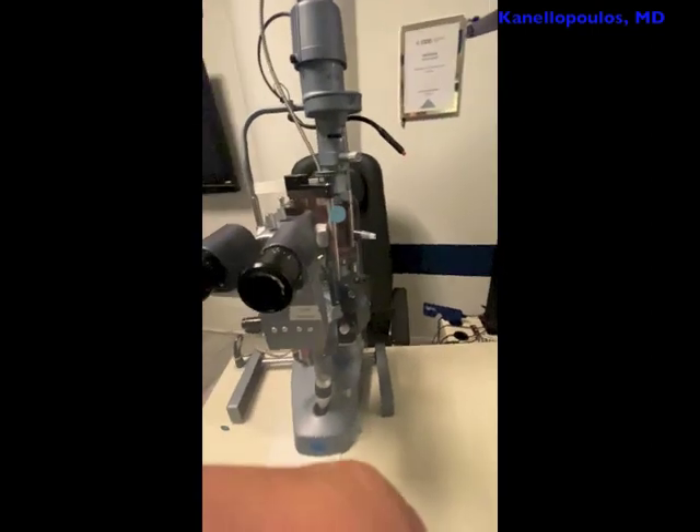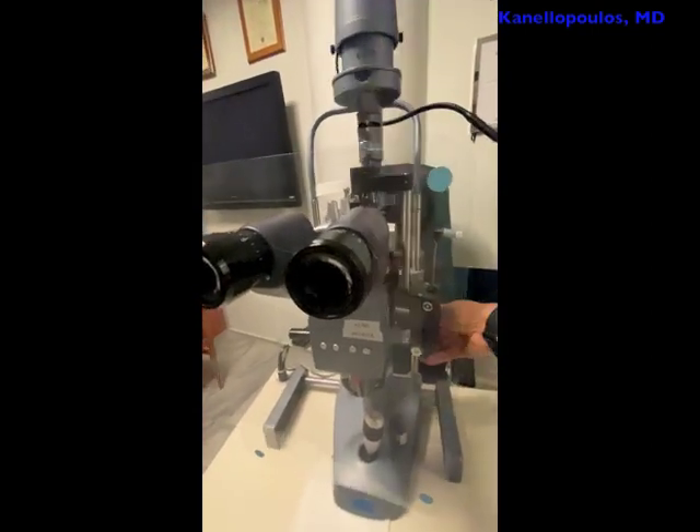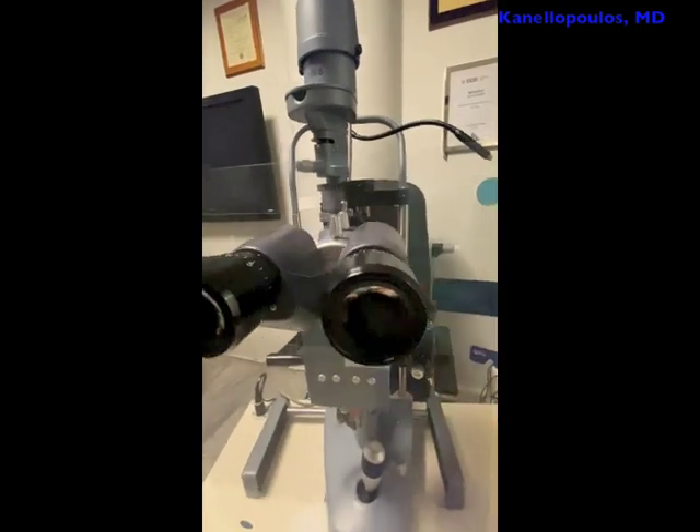Intraocular pressure measurement — I'm going to switch hands here on my iPhone, I apologize. All the measurements, all the settings can be done very easily with the hand moving around the shield.